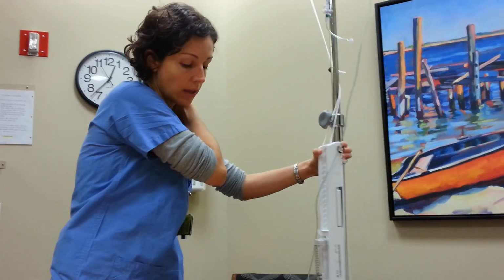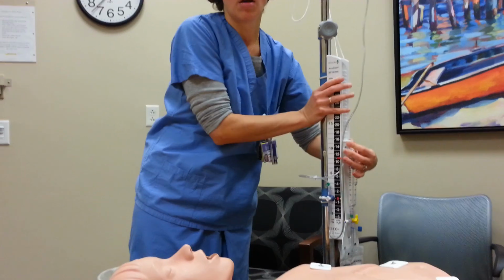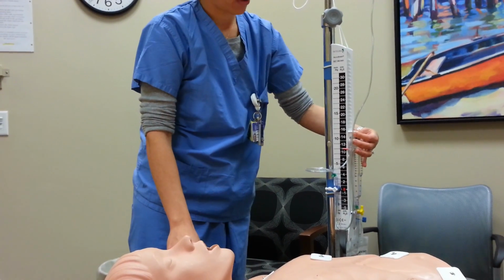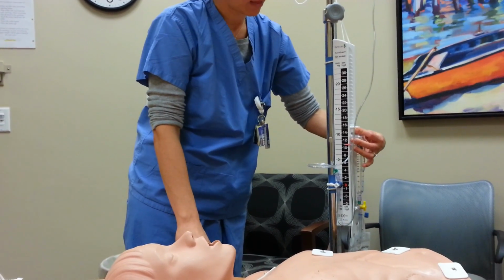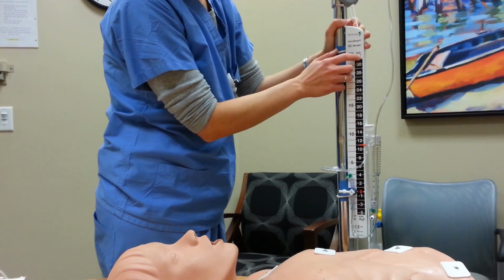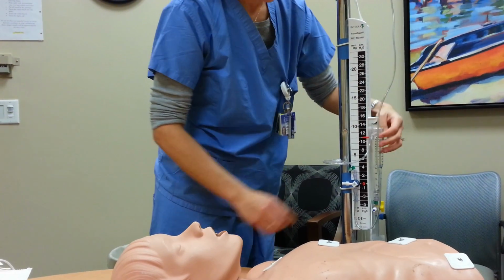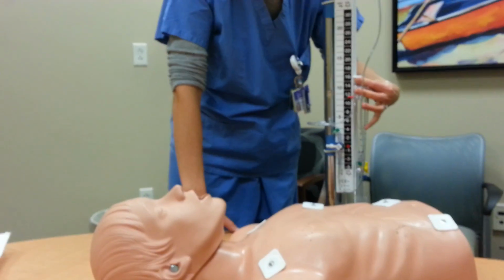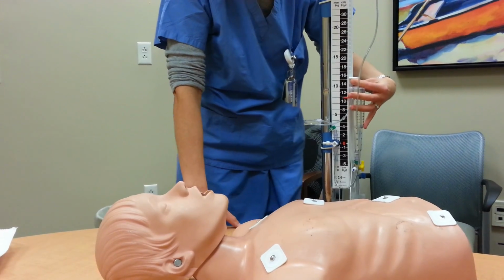Once you have it level, you want to make sure the burette is in the right position on the drain itself. So the neurosurgery team will typically prescribe a certain level above the tragus that they want, which of course will result in more or less fluid being drained off. And they'll usually say 10 above the tragus, 15 above the tragus, 20 above the tragus. On the drain itself, it has centimeters of water and millimeters of mercury. When they say 10 above the tragus, they mean centimeters of water. And it's easy to remember because the red will always be in the black. So you can squeeze the burette and slide it up and down like so. So if they wanted it at 10, you would leave it right there.